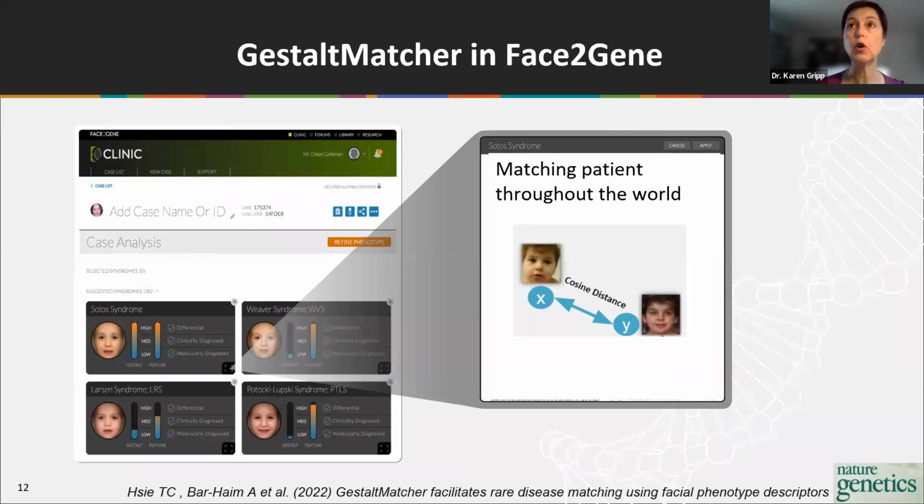So as I said, I'm hoping that this new technology that's very powerful and that allows you to compare a single patient image to other single patient images rather than to previously trained syndromic categories is going to become very powerful. It's going to help you make potential diagnosis or consider differential diagnosis for your patients.